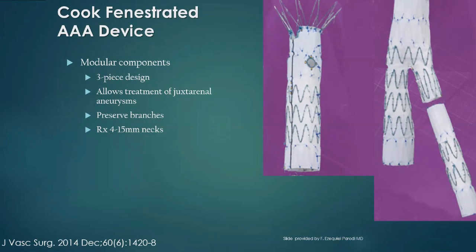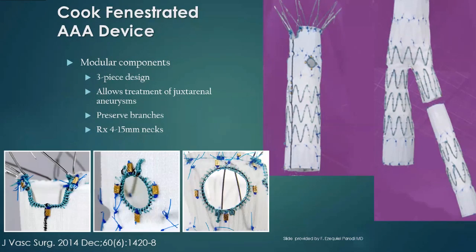So this is what the stent graft looks like. This one is for a juxtarenal AAA. So, sorry, I got stuck there for a second. So actually we have a scallop. This is scalloped. So this will snug right up against the SMA. And then you have the fenestrations for the renal arteries, and then the body and the contralateral limb. And these little markers are the radiopaque markers. So under fluoroscopy, the surgeon is able to know if they're AP, the positioning of the stent graft. So that guides them.